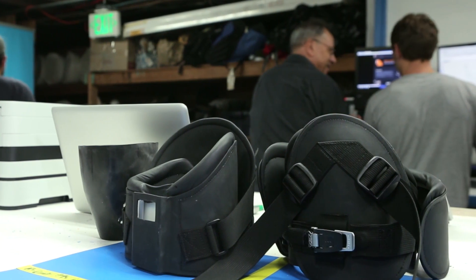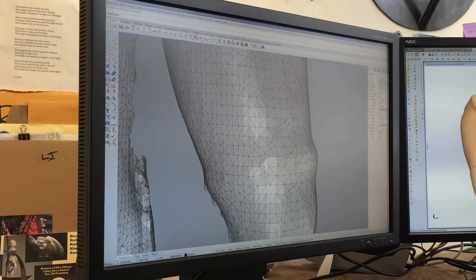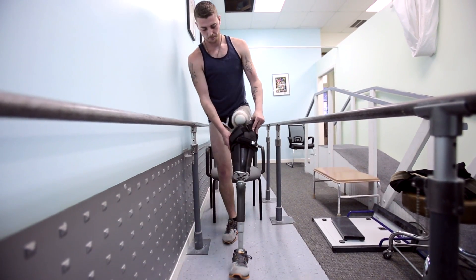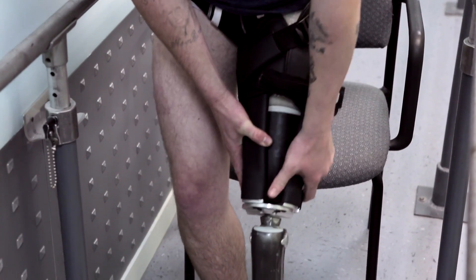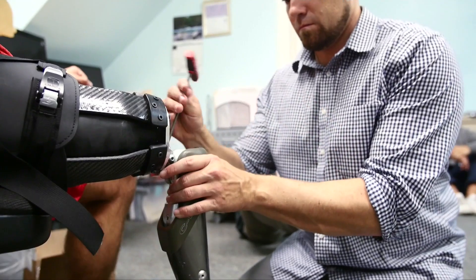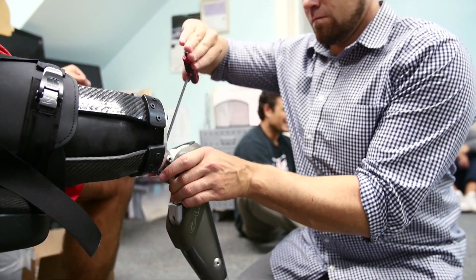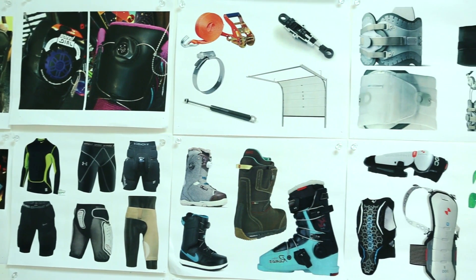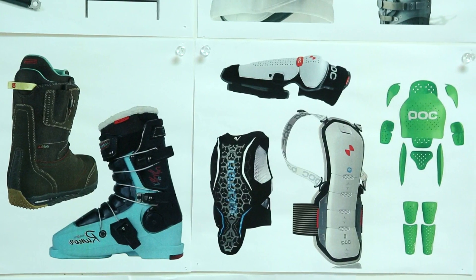The limb is dynamic — different portions of the limb also change on a day-to-day basis. Residual limbs fluctuate about 10% in volume over an extended period of time. With the infinite socket, we've built in adjustability to essentially become a dynamic device. We took a lot of inspiration from the athletic industry, specifically snowboard boots in terms of how they conformed around the limb, especially the ratcheting buckle system.